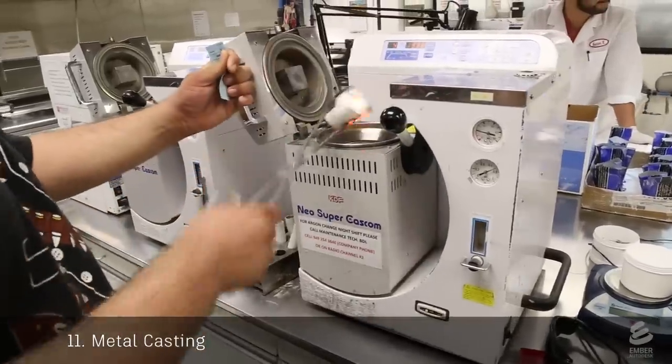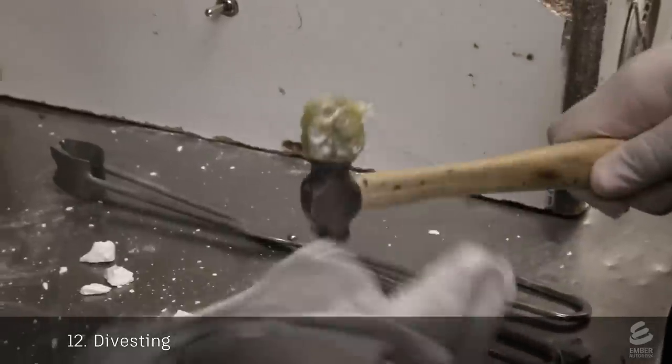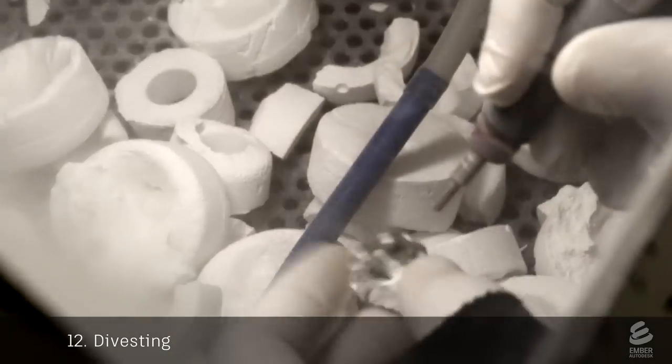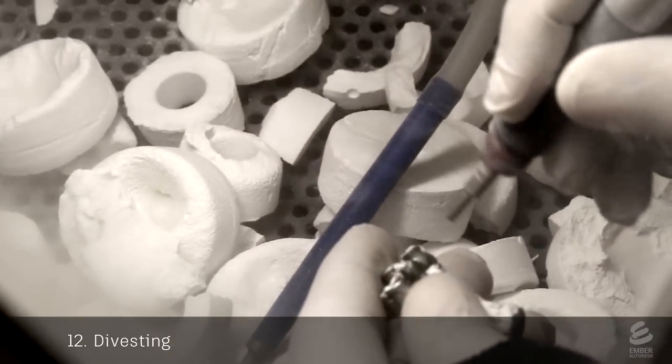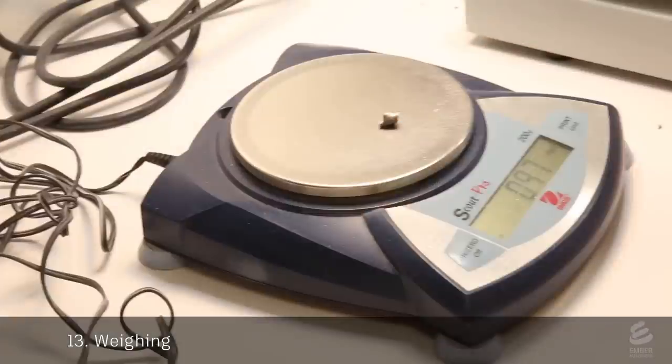The casting is removed from the machine and left to cool. In a process called divesting, a technician breaks apart the investment with a hammer and uses an air gun to remove any remaining pieces of investment. He cuts off the sprues and weighs the castings to determine the price.